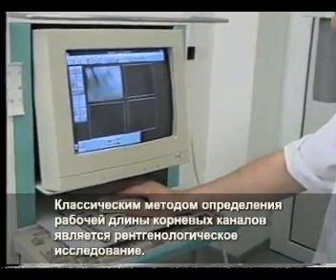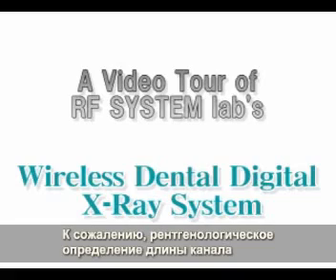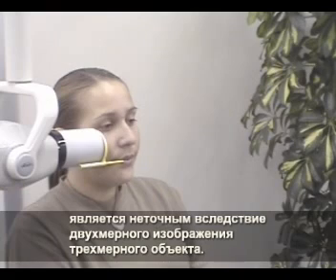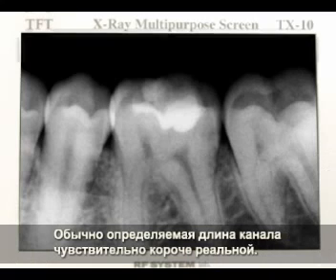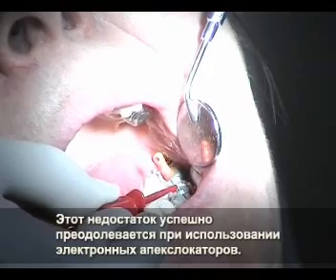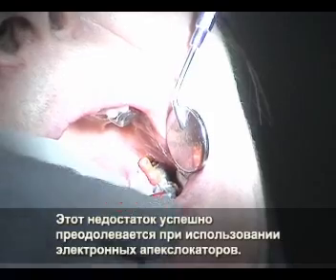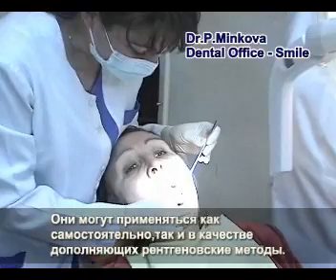X-ray testing is a common method of determining root canal length. Unfortunately, the X-ray determination of canal length is inexact in most cases because of the two-dimensional image of a three-dimensional object. Usually, canals are determined as considerably shorter. The disadvantage is successfully overcome using electronic apex locators. They can be used either independently or in addition to the X-ray methods.